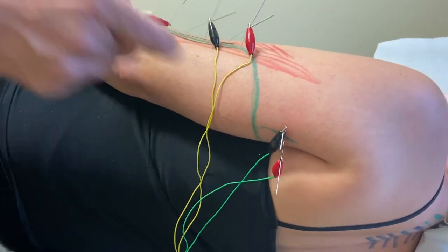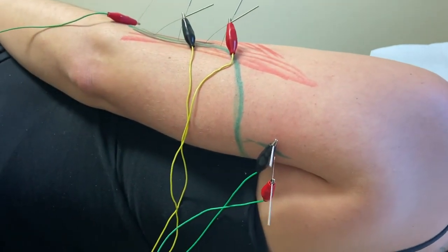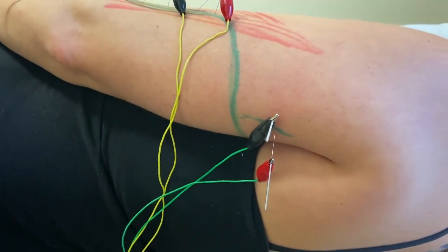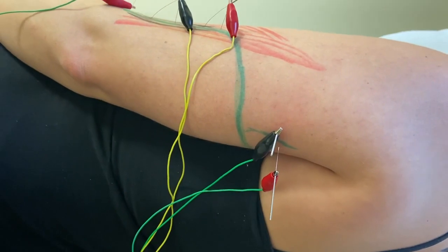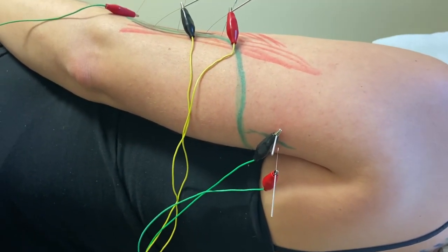Now you're going to feel a little pulse right here. There we go. Doing okay? Mm-hmm. I'm going to make it closer to 2 hertz here.